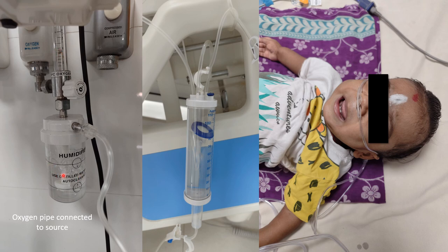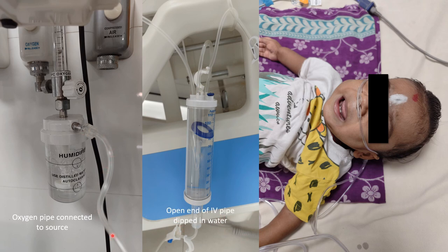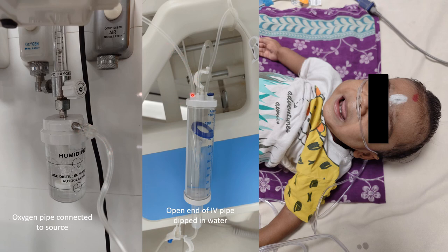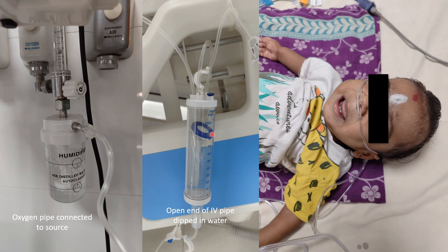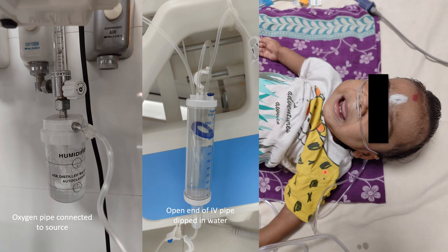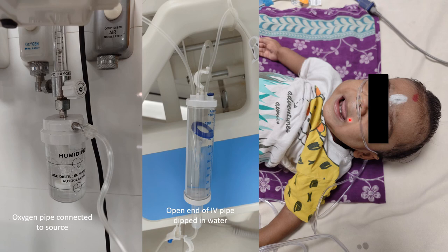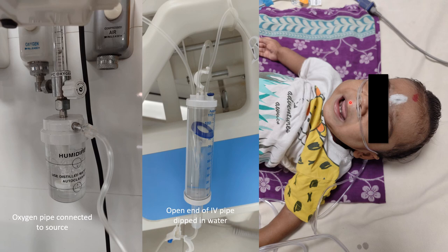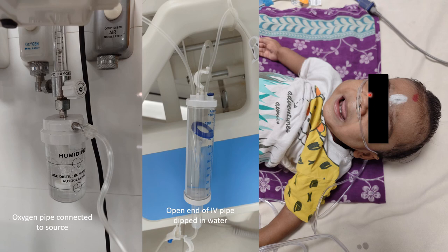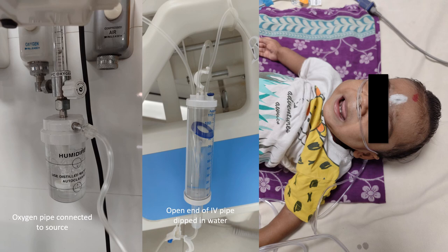The flow is confirmed by bubbling in the chamber. The open end of the IV pipe has been dipped inside the pedi chamber containing some water. The other end of the nasal cannula is applied to the patient. So three things are attached: the oxygen pipe to the oxygen source, the nasal cannula to the patient, and the IV pipe dipped inside the pedi chamber.